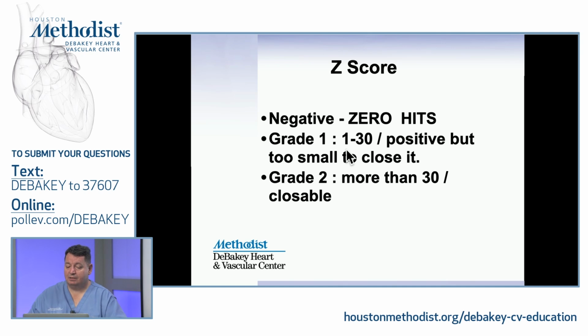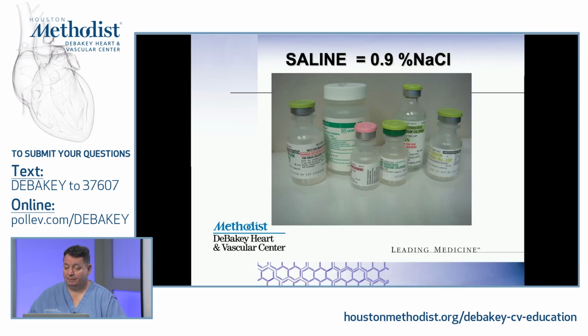That is my two positive criteria. And my neurologist colleague, Dr. Volpe, convinced me that we should not withhold our criteria of 65 and younger. Previously, that was a cutoff for testing for PFOs. And we just learned that, again, as we are getting older, we want to get tested too. Also, our patients, maybe while we're getting older, there's remodeling, resizing of the heart. They may have some other changes that may see PFO in older people too.